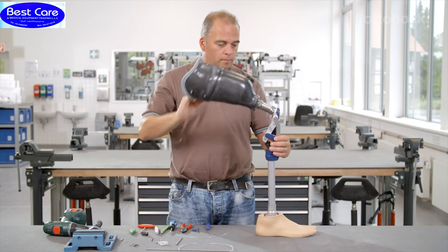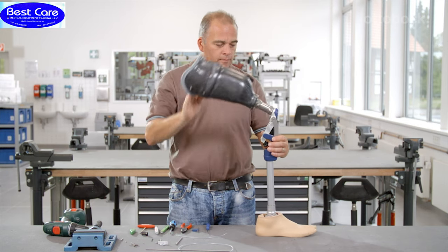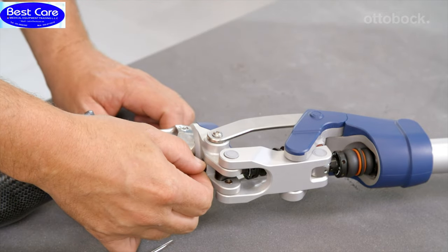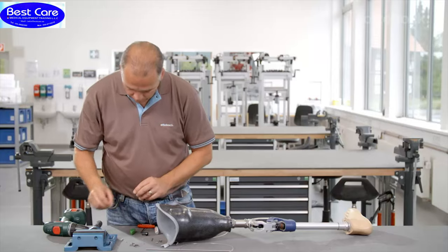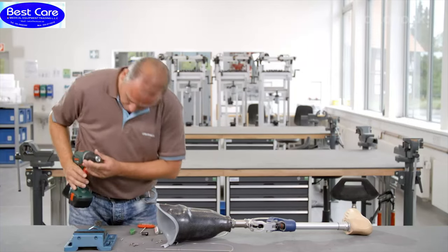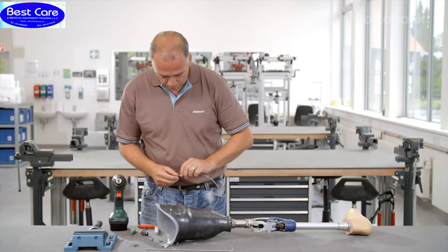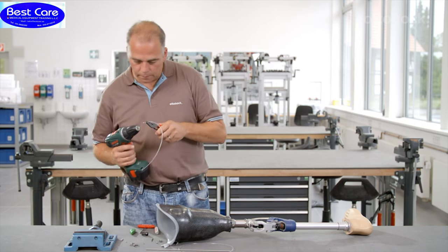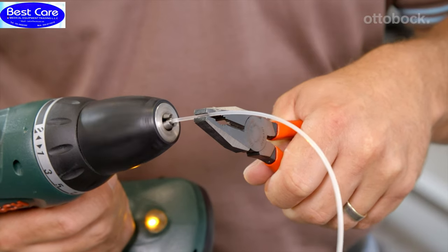PHEON is delivered with the lock deactivated. The knee joint can be freely flexed. Please observe the following instructions for installing the lock release cable and activation of the lock. After installation, please check whether the lock release cable has been installed in accordance with all the instructions. All instructions can be found in the instructions for use and the assembly instructions.